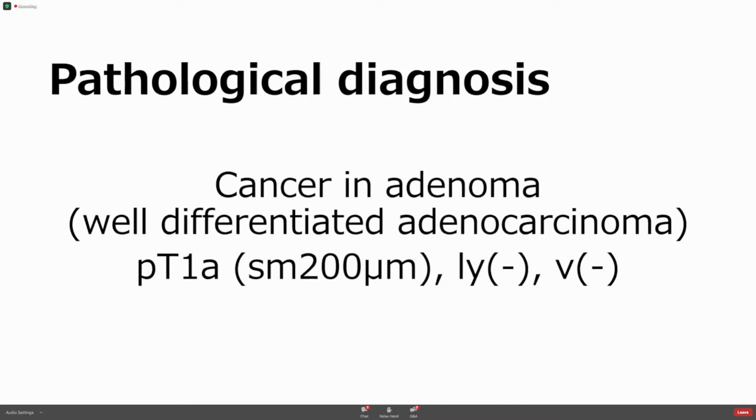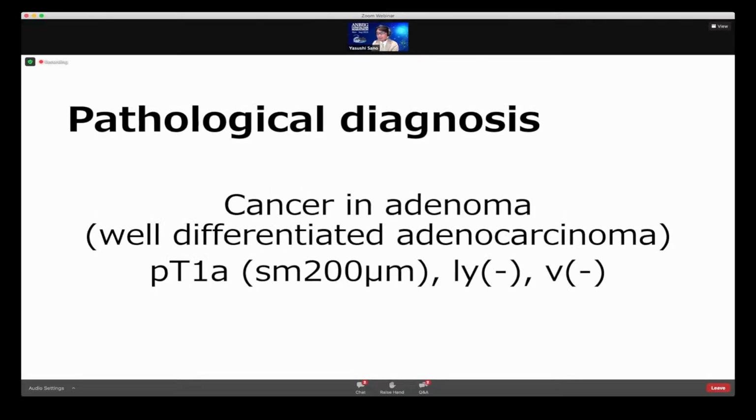Endoscopically it looks villous, but sometimes such a region invades deeper into the submucosa. So anyway, en bloc resection or deeper resection is very important, to resect en bloc. Yes, this one, such a villous tumor.